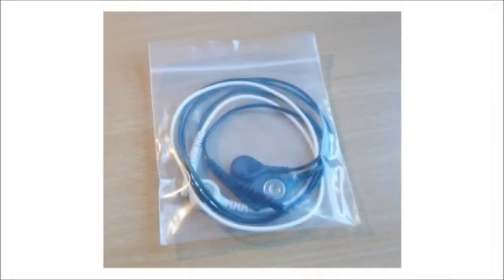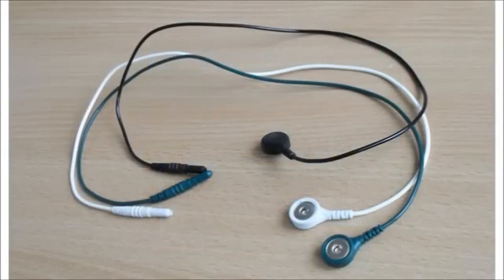To measure EMG we need three sensor cables. Here they are in their packaging as you'll find them in the rental device. There's a black one, a white one, and a green one. The black and white are known as the active sensors — when we place them on the skin we're essentially measuring the muscle tension between these two, so how we position them matters. The third cable, the green one, is known as the ground. It's less important where it goes; anywhere near the others is fine.